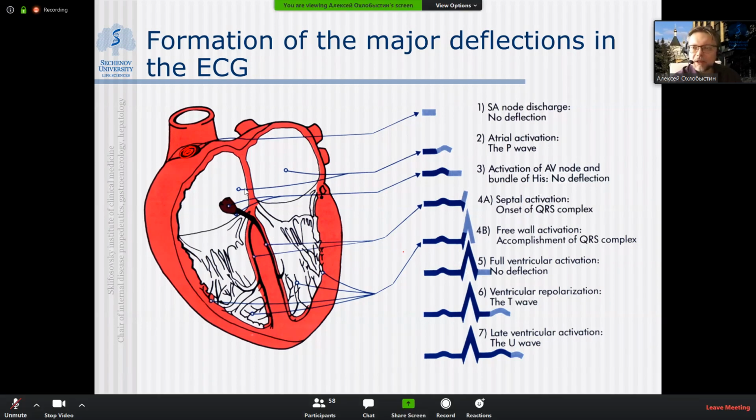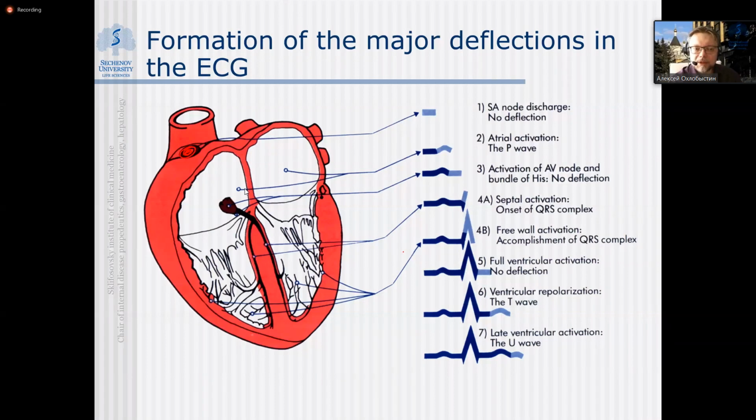Good. The question to all of you will be, what will be the representation of the sinus node activation in the ECG?